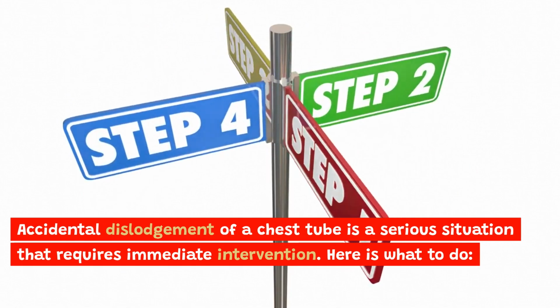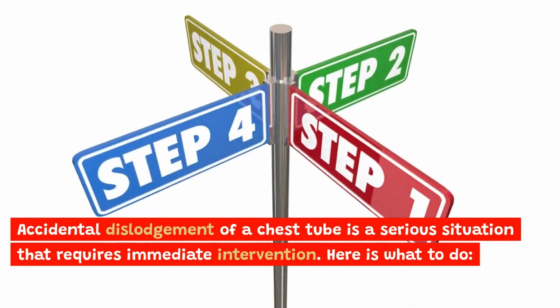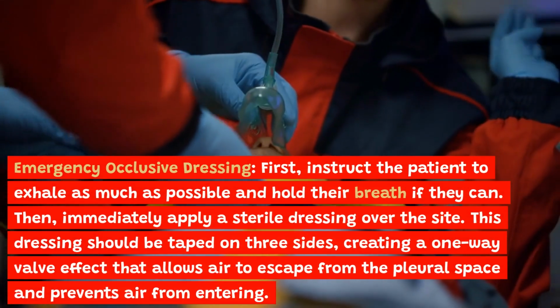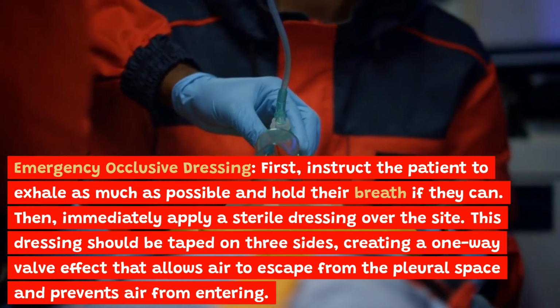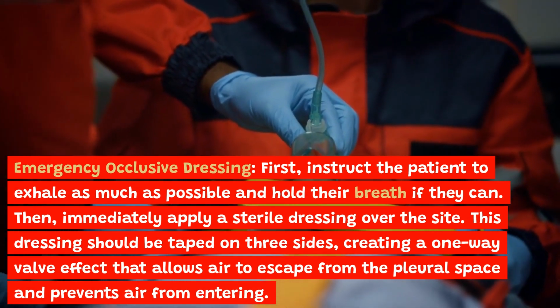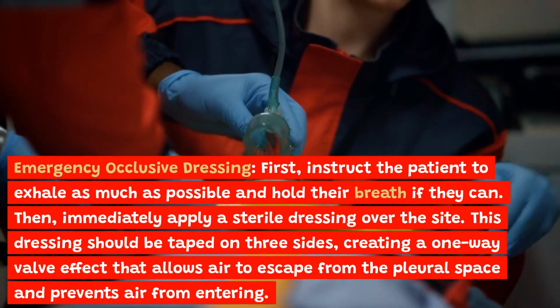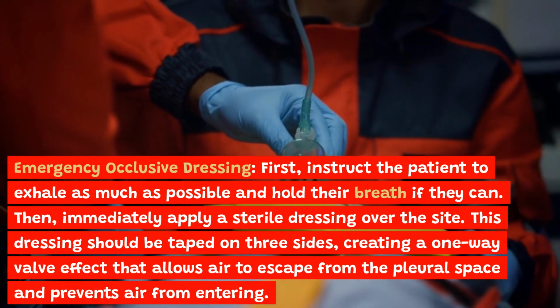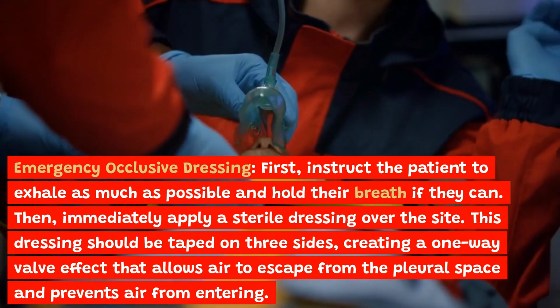Accidental dislodgement of a chest tube is a serious situation that requires immediate intervention. Here is what to do. Emergency occlusive dressing. First, instruct the patient to exhale as much as possible and hold their breath if they can. Then, immediately apply a sterile dressing over the site. This dressing should be taped on 3 sides, creating a one-way valve effect that allows air to escape from the pleural space and prevents air from entering.